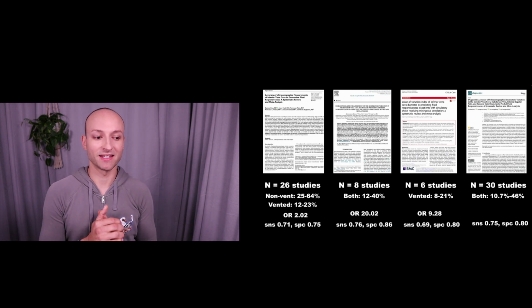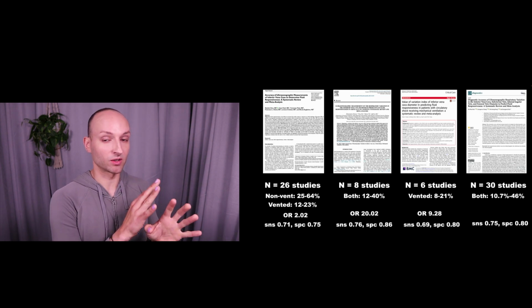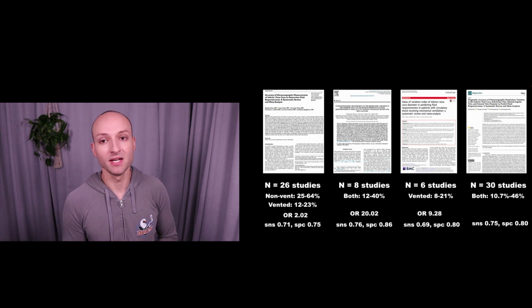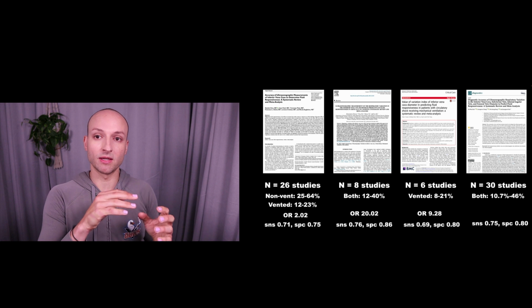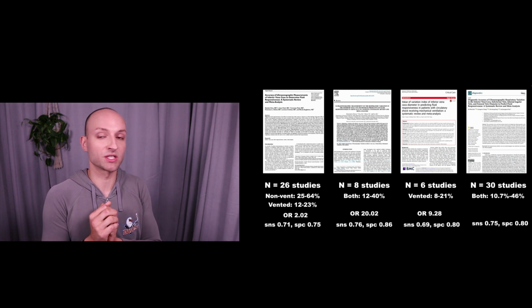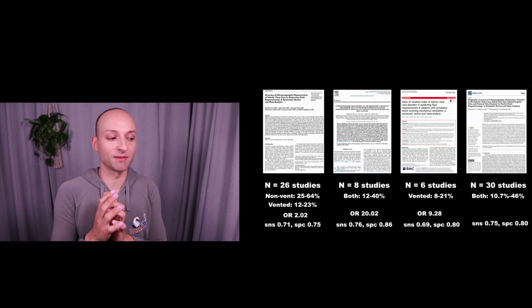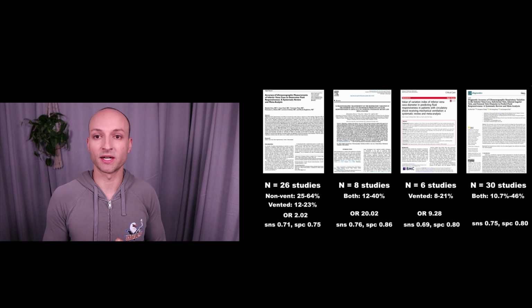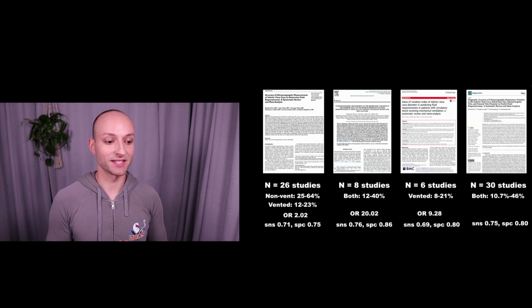If we look at the literature, there are a lot of studies out there. There are 4 meta-analyses that I was able to find that actually talked about this. Some of them even separated out the number at which somebody would be considered volume responsive or not, versus ventilated versus not ventilated. But let's look at the broad range here. Let's look at that third study, the one in Critical Care 2018, which included 6 studies.